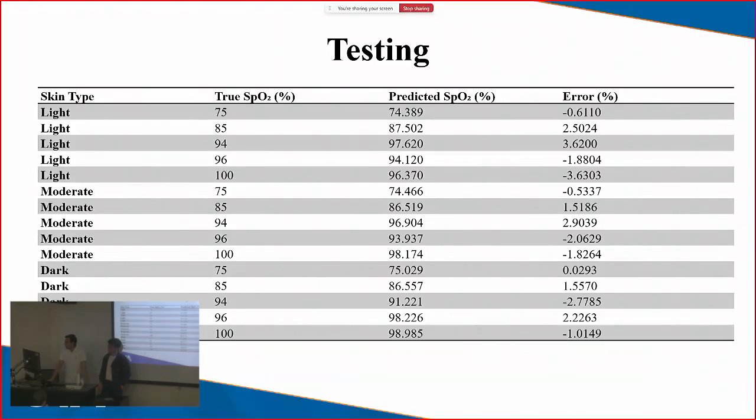But we need more data to calibrate it more, and this is a good start, because when we have the actual device, it's not like the MCX, because the LED emits around trillions or billions of photons. I'm not really sure about the values, but it just shows which is the best wavelength we can use for our case.